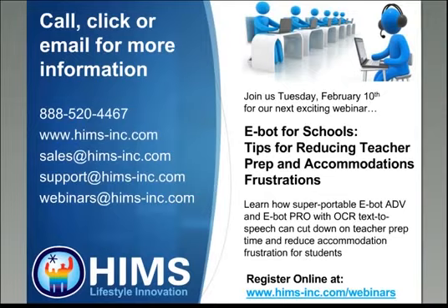Marilyn wrote, when will the BrailleSense use UEB symbols in computer Braille mode? Computer Braille and UEB are two technically different codes, so I'm not sure if I have the knowledge to answer that. We support UEB now. It's one of our tables that are supported. Computer Braille is a little bit different in that it was designed back in the early 80s to be one symbol, one thing, so you wouldn't have things like dots 2, 5, 6 being a 4 sometimes and a period sometimes. So I'm not sure specifically what you're looking for there, other than we've supported UEB for some time.